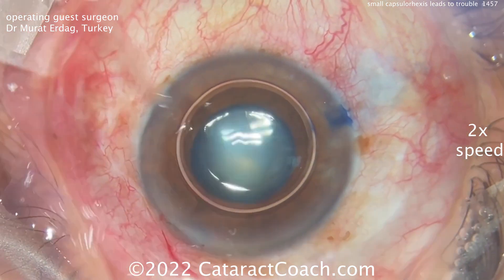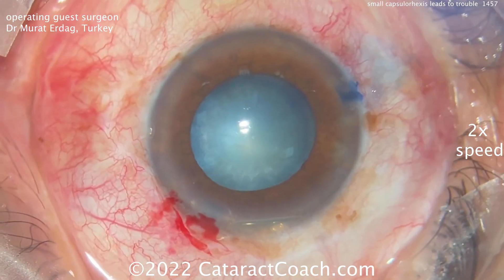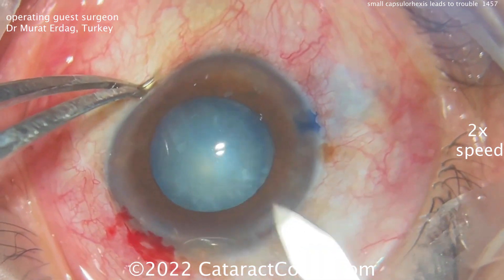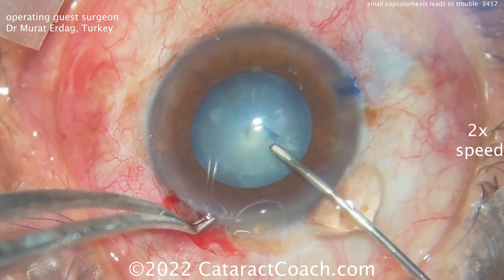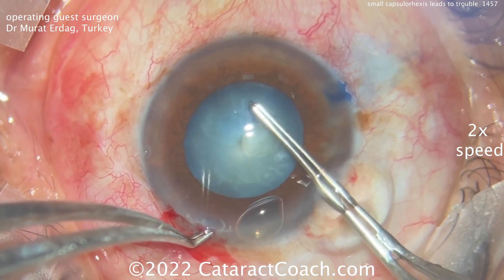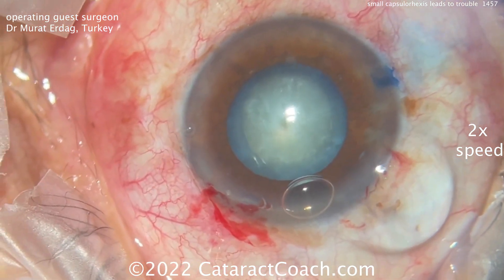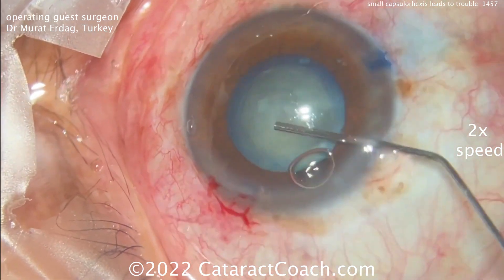In a case like this with a small Rhexis, the only situation where I really want a small or baby-sized Rhexis is when I'm worried about the IOL staying in the capsule bag — for example, a combined cataract and retina surgery where a gas bubble in the eye may cause posterior pressure and push the IOL optic out of the bag. Or a combined phaco-trab case where post-op hypotony causes the AC to collapse. In those cases I'll do a 4.5-millimeter Rhexis. But with this much dilation, I would have liked a much larger Rhexis coming up close to the pupil margin.